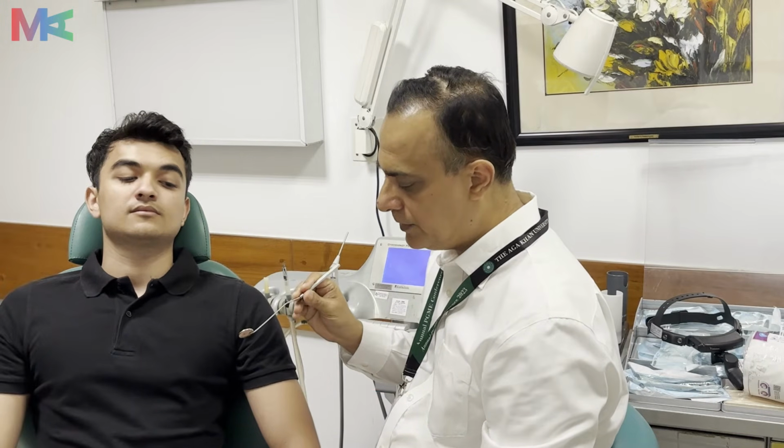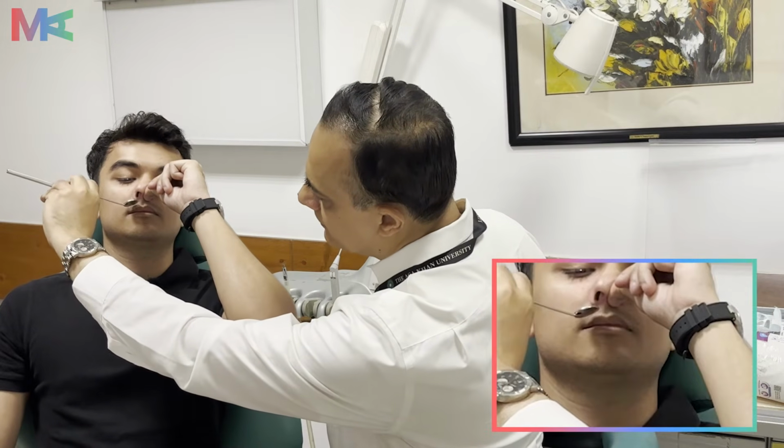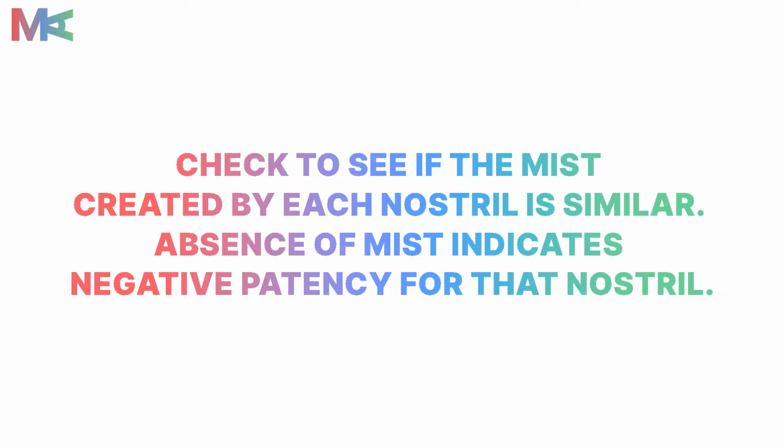Similarly, you will ask the patient, ये side बंद कीजिए और इधर से सांस लीजिए. And we'll check for the fogging of the mirror. If the fogging is there, the nasal patency is there.